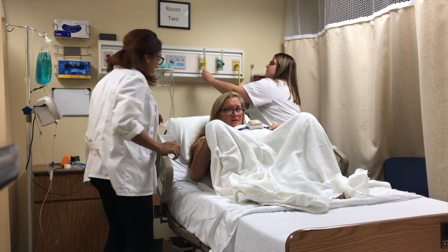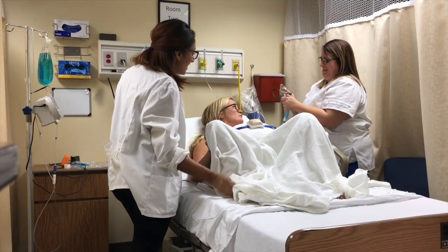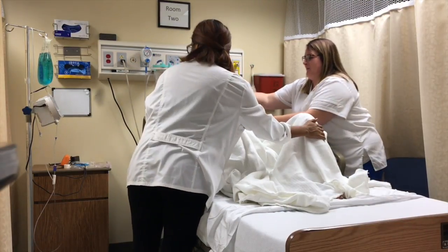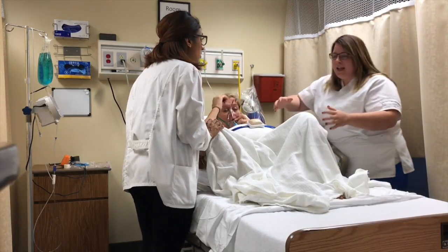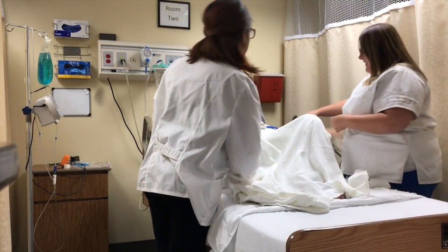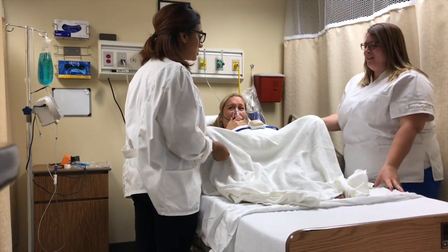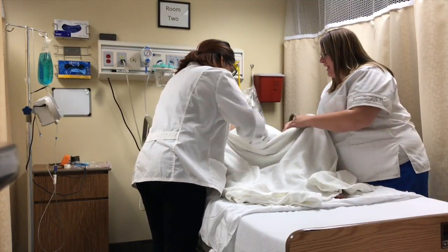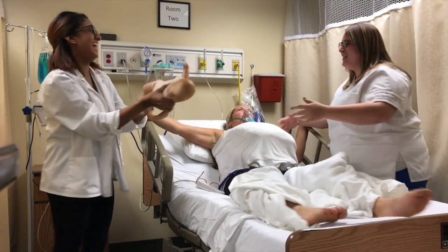That's for you. Your baby is lacking oxygen right now. Is this helping? It's not helping. The heart rate's still dropping. She's at 80. We need to examine the vagina. I think we need to get the baby out. Oh, her umbilical cord is being pushed. Right now? Time to get that baby out of here. We need to get it out. Oh, look, it's your new baby.